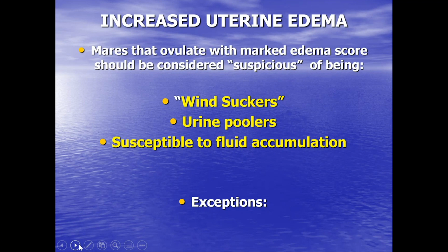A couple of exceptions I want to mention. Don't know if any of you can think of them. Mares given deslorelin. Deslorelin does have the ability to drive the follicle to ovulate, and there may still be quite a marked endometrial edema pattern at ovulation.